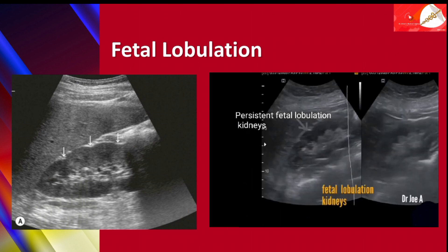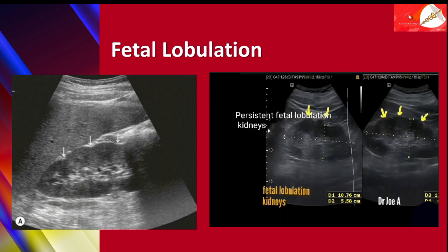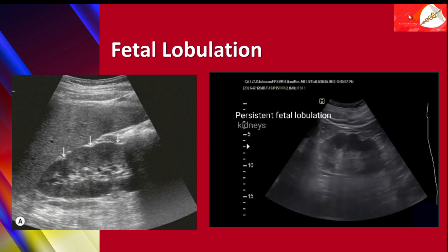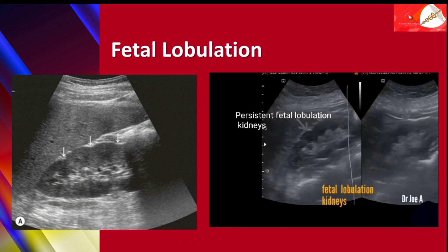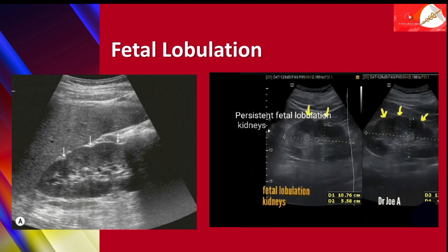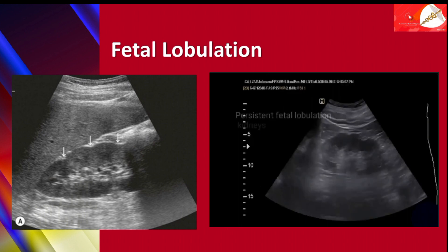Again, in this GIF image of an ultrasonograph, you can see persistent fetal lobulations, with arrows marking and indicating the indentations on the renal surface.